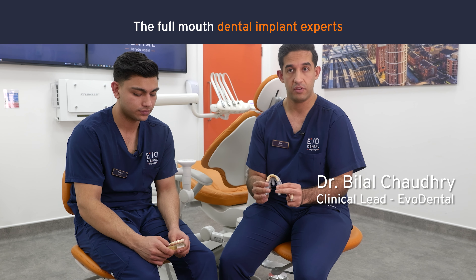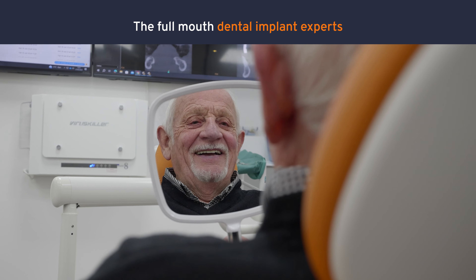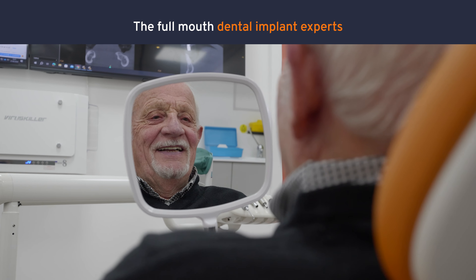EVO Essential is four implants that are placed in the upper and lower jaw that holds 10 teeth, supported by a metal bar giving you a nice natural appearance.